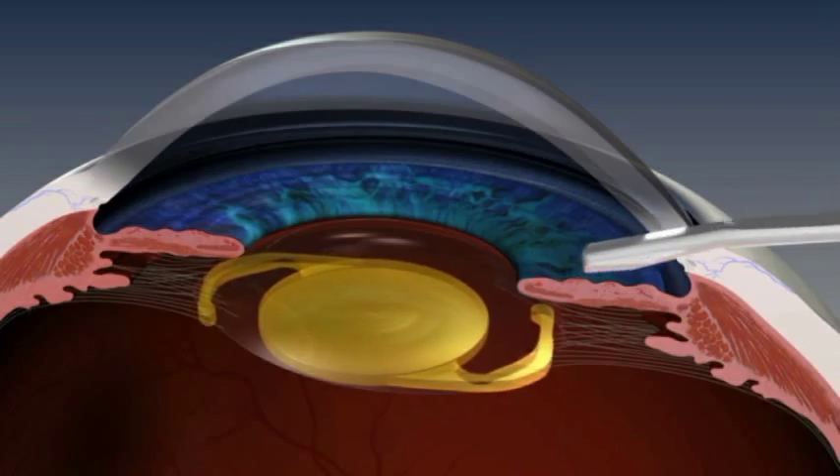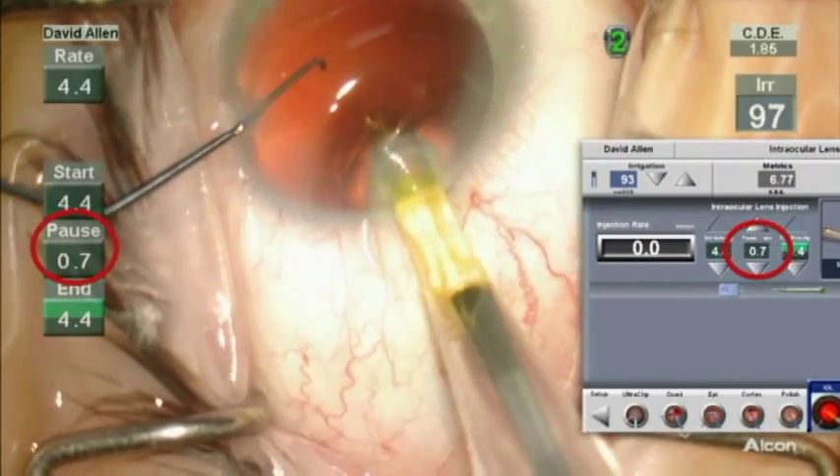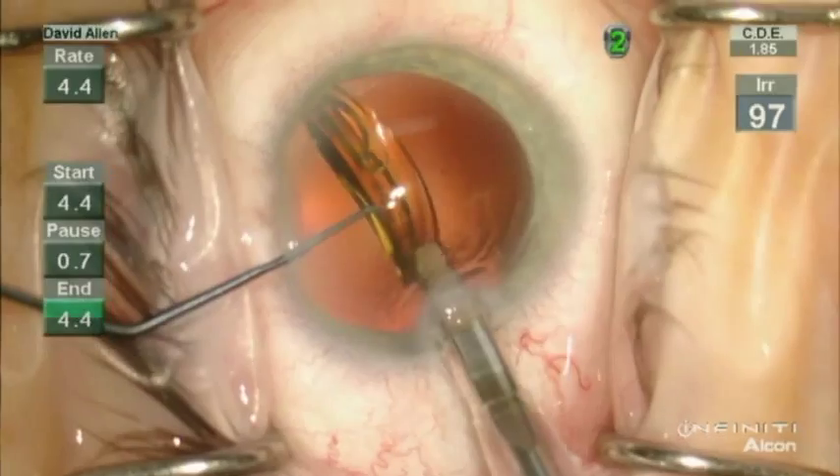With AutoCert, the innovative surgeon-selected pause feature helps reduce stress on the IOL.